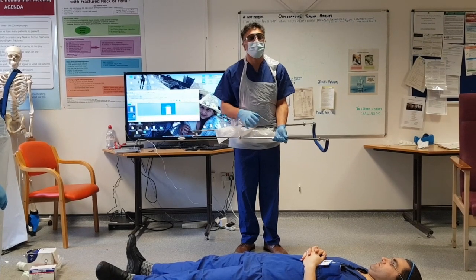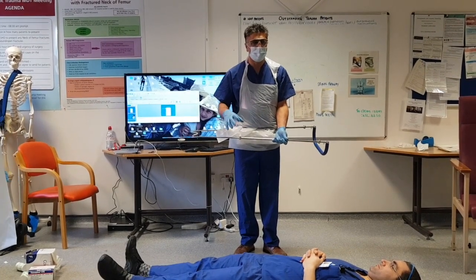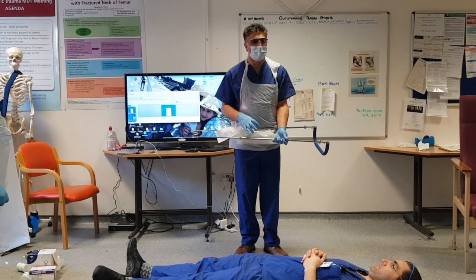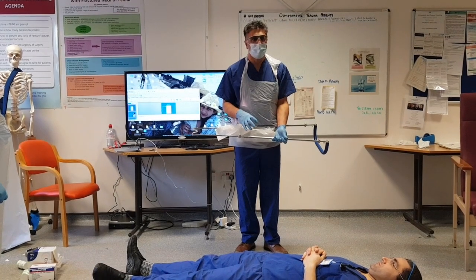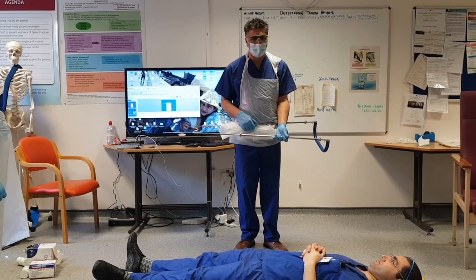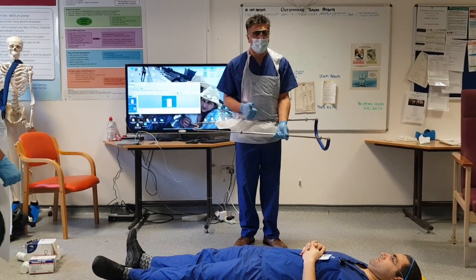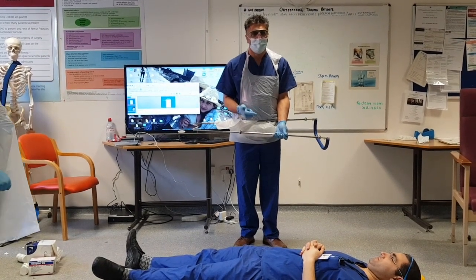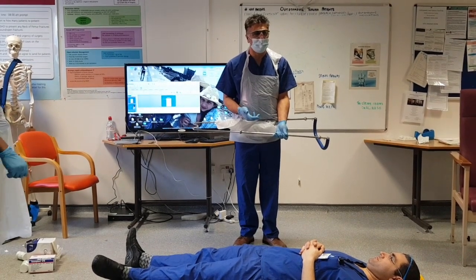The way that works is by stretching the muscles over the top of the bone. The bone will come out to length, and by stretching the muscles that will tamponade the bleeding and hopefully stop there from being too much movement, which will help with pain. So the reasons that we're applying it are: one, for alignment; two, for pain relief; three, for control of any bleeding.